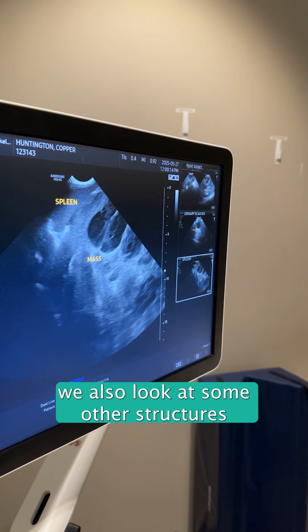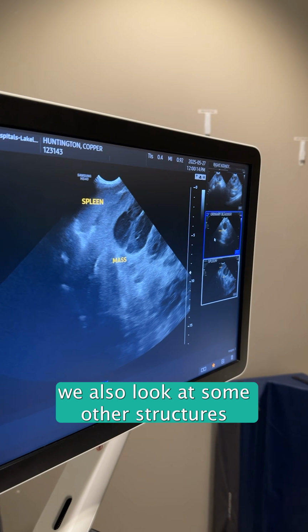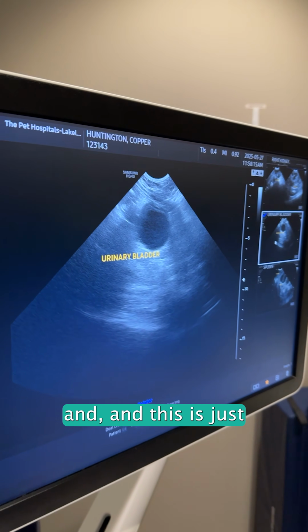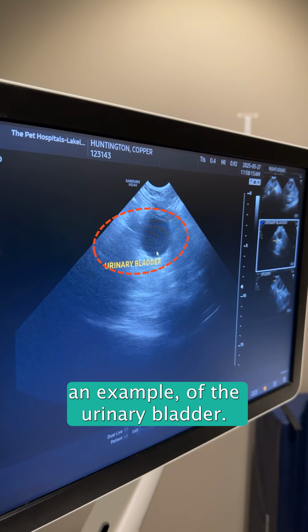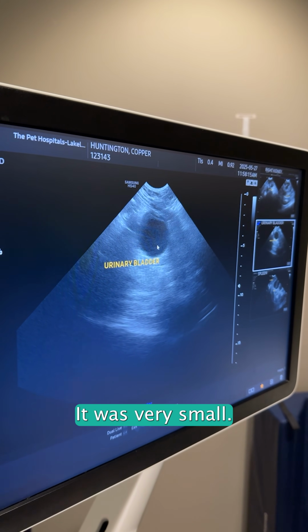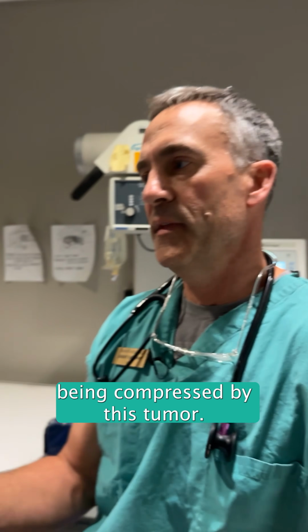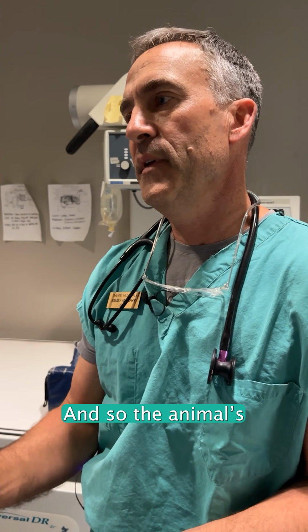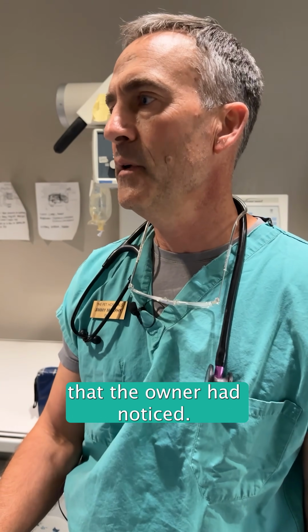And so we also look at some other structures, and this is just an example of the urinary bladder. It was very small. It's not able to fill normally because it's being compressed by this tumor. And so the animal's having to urinate often, and that's another complaint that the owner had noticed.